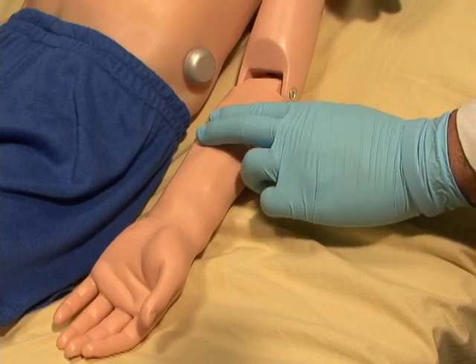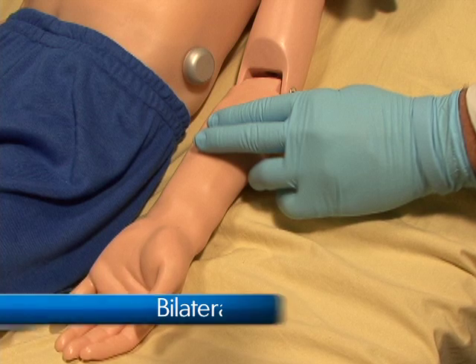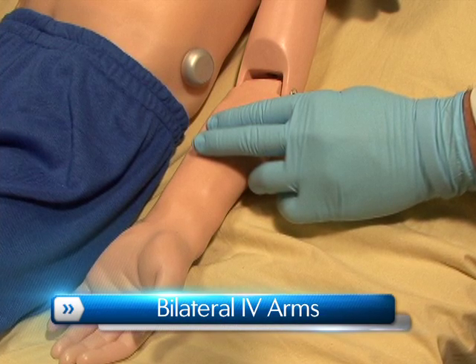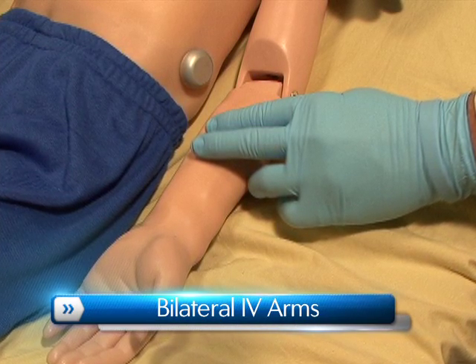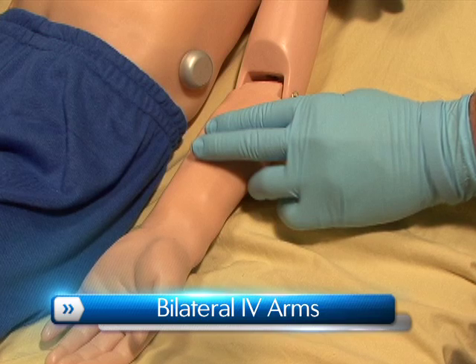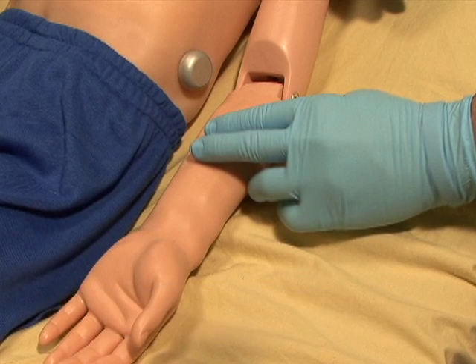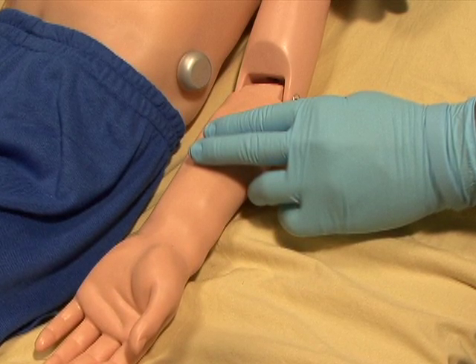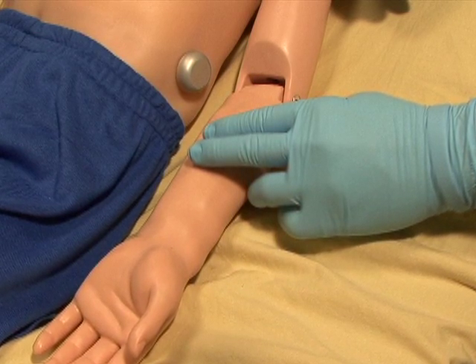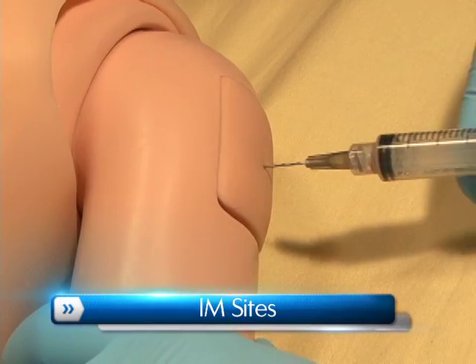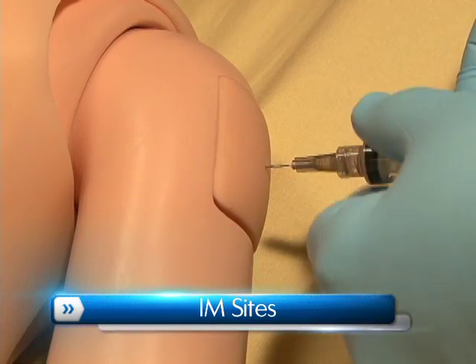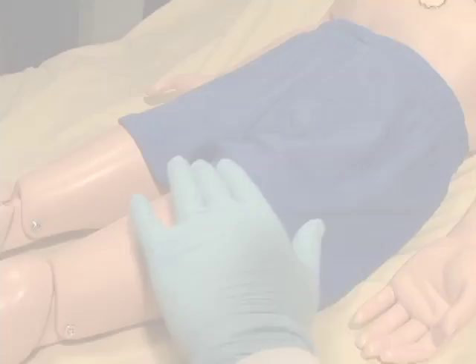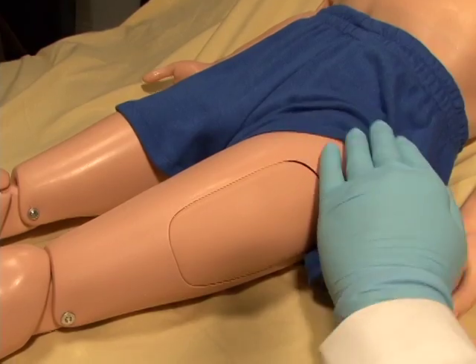Pediatric HAL has bilateral IV training arms that can be used for bolus or intravenous infusions, as well as for drawing fluids. In addition, he has IM sites on both his deltoids and quadriceps.